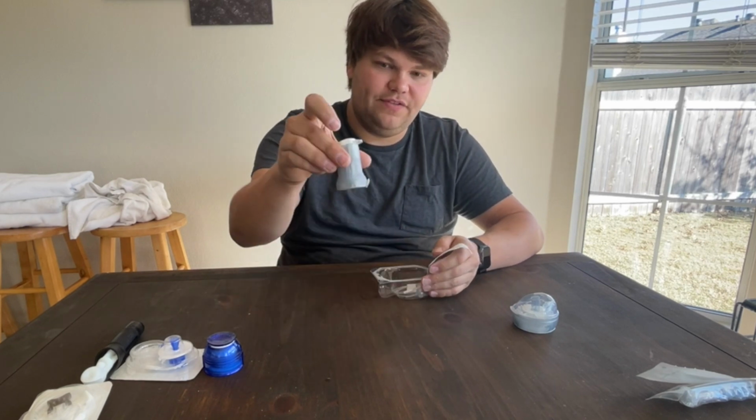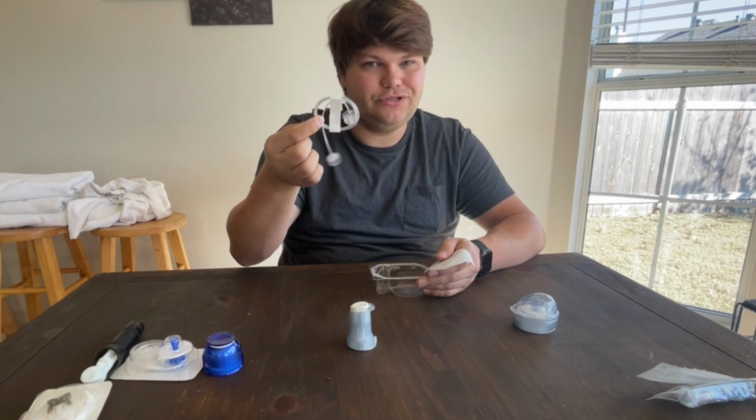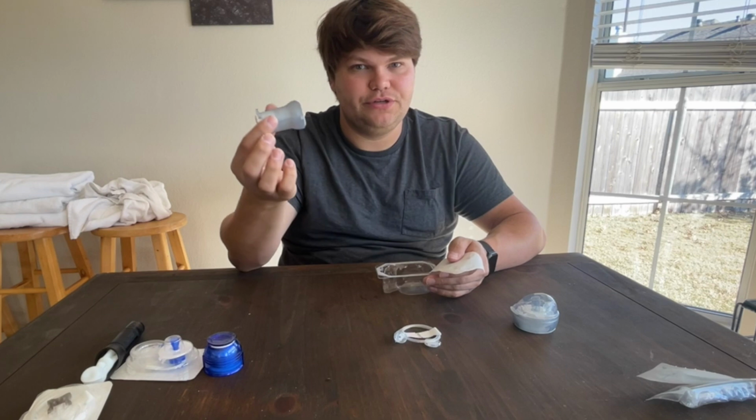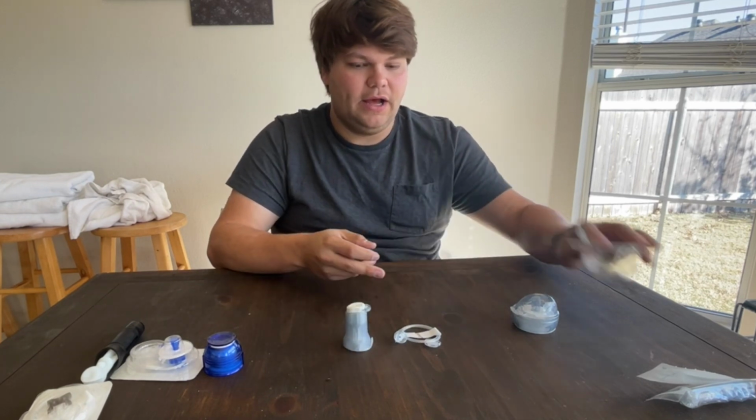But you have the infusion set and the inserter, and then separately is your tubing, which I do kind of like. You can save that tubing if for some reason your infusion set failed and you needed just this part, you can save the tubing for later.